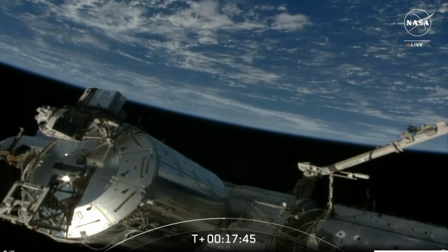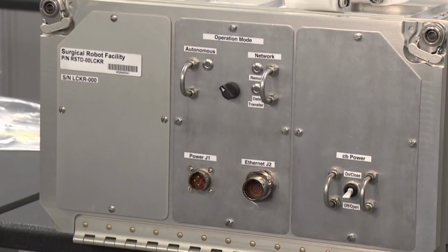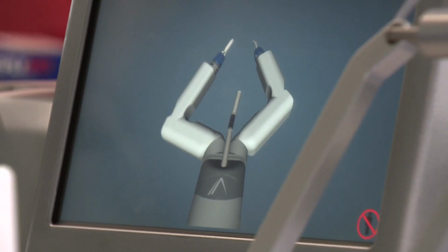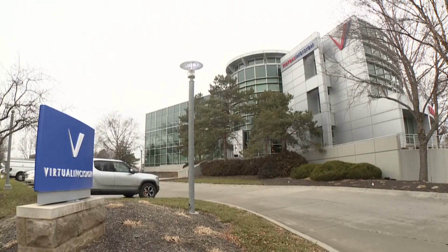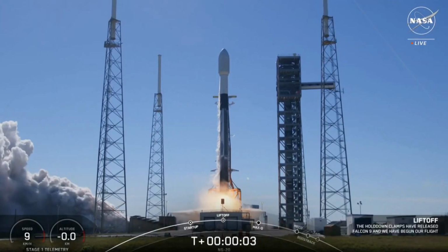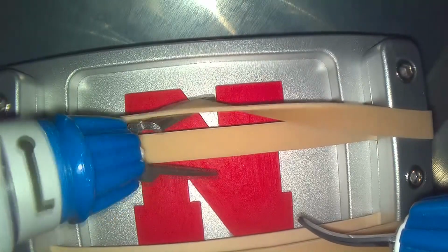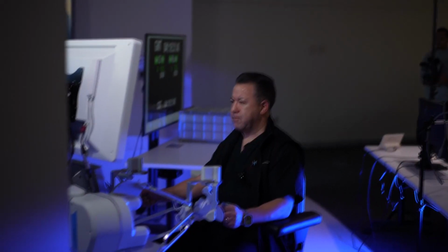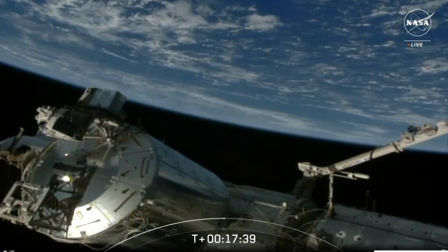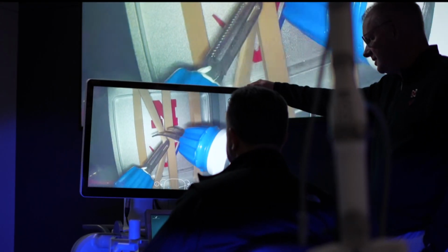Wrap your mind around this. This box the size of a microwave with a robotic science experiment inside was assembled in Lincoln through a partnership with the University of Nebraska and Virtual Incision. Two, one. And sent to the astronauts last month on the International Space Station. The idea seems simple. Use the robotic arm to cut simulated tissue. Here's the big deal. The first surgeon is using the hand and foot controls in Lincoln to control the grasping and cutting. Don't forget, the surgery is in space. You did pick the hardest one to cut.